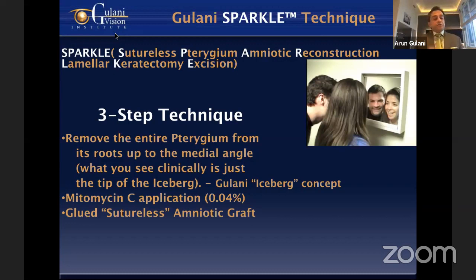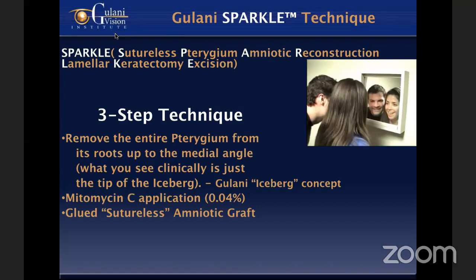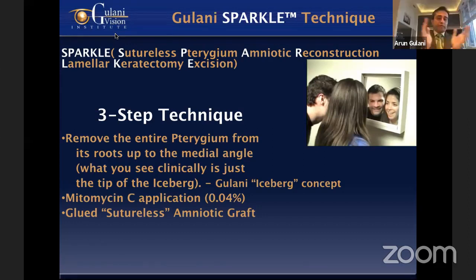Three-step technique. First, you saw me in every case with a pinguecula or pterygium, I was dissecting right up to the roots. That is vital. I believe that is the most important part of not having recurrences and the patient doing so well. And of course, mitomycin C application in 100% of cases for 20 seconds.